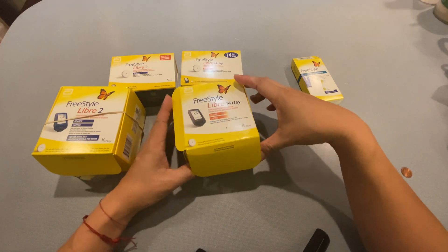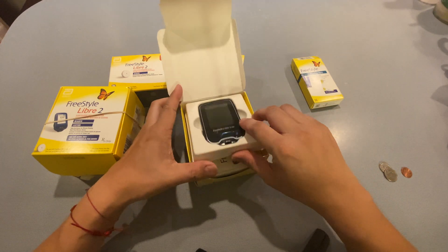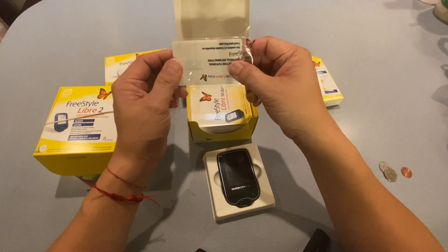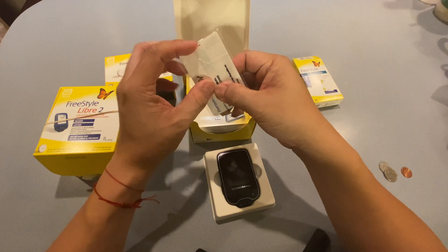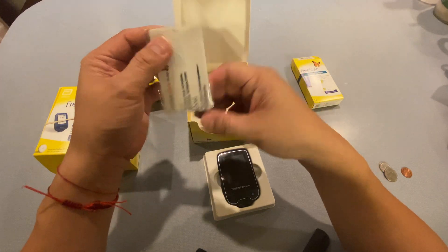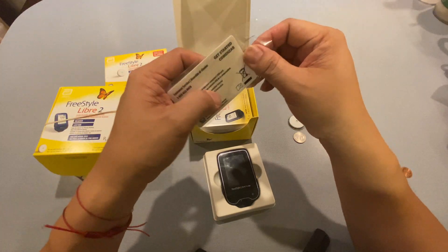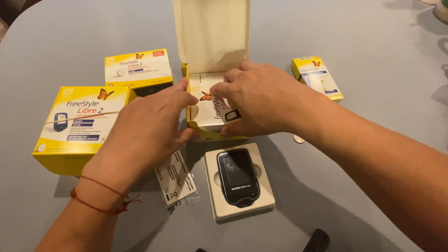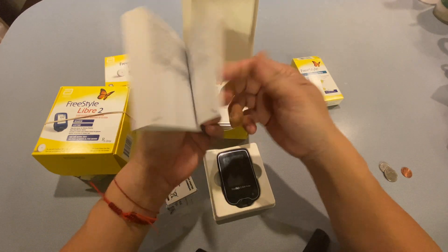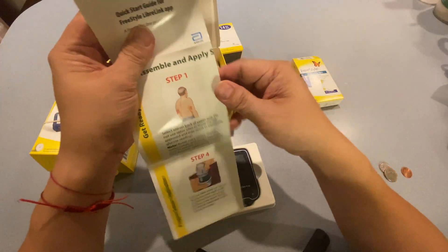Let's get on with the unboxing. Inside the Freestyle Libre 14-day system, you get the reader, a lot of informational booklets, and a USB thumb drive built into a plastic card. This contains instruction booklets with quick tips on how to use the system. You also get a massive booklet on how to use your sensor, and there is a quick start guide so you don't have to read the entire booklet.